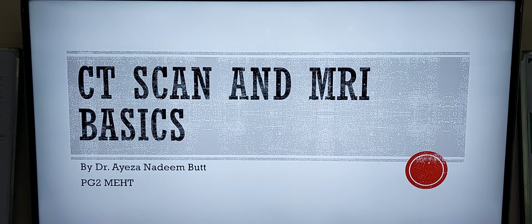What does CT scan stand for? Computed tomography. It uses X-ray beams to obtain tissue density values. The detailed cross-sectional images are then formed by a computer. Tissue density is represented by a gray scale, white being maximum density, which is shown by bone, and black being minimum density, which is shown by air.